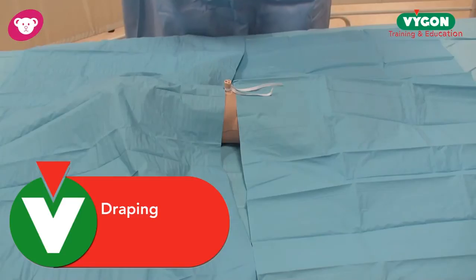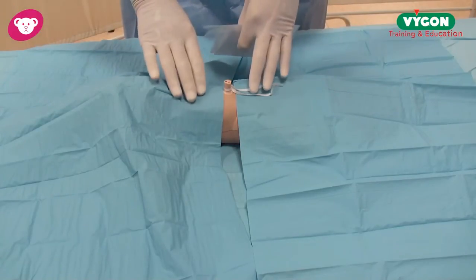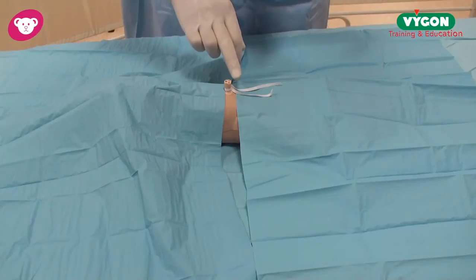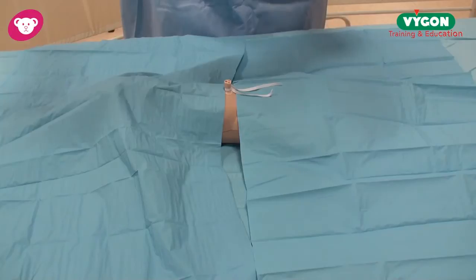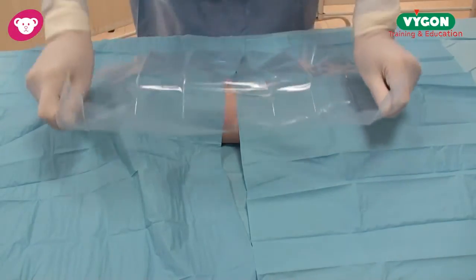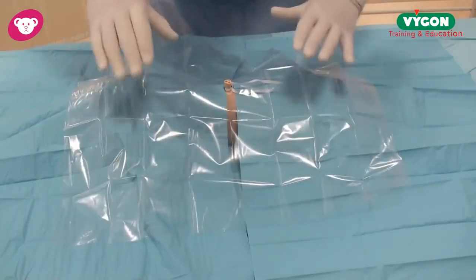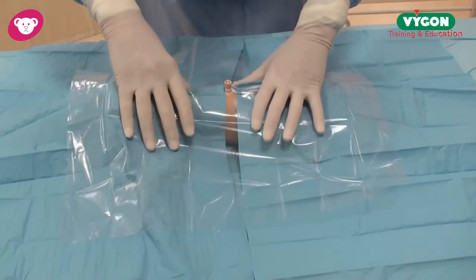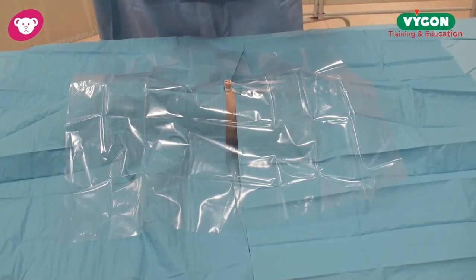I've now cleaned the umbilical area, I've placed a drape on the upper torso, and a drape on the lower torso as you can see here. There is an umbilical cord tie in place to stop hemorrhaging, and now I'm going to place our unique transparent drape which is also peelable. We'll put this in position now, and as you can see we have excellent barrier precautions for the baby, and now we can start to proceed to place the umbilical catheter into the baby's umbilical vein.